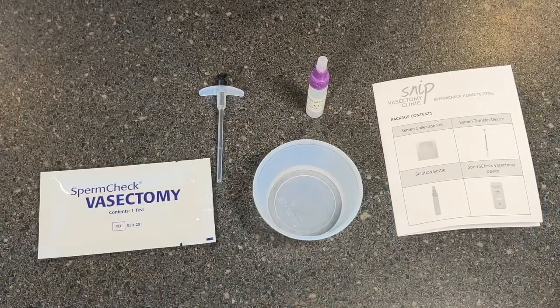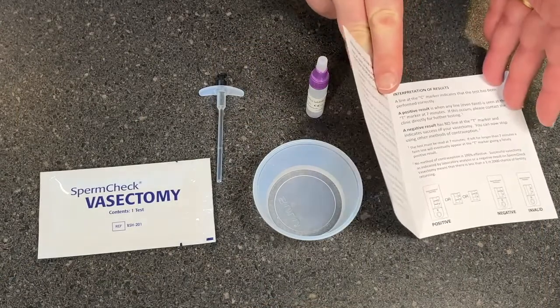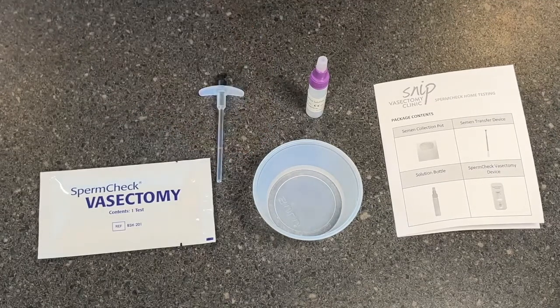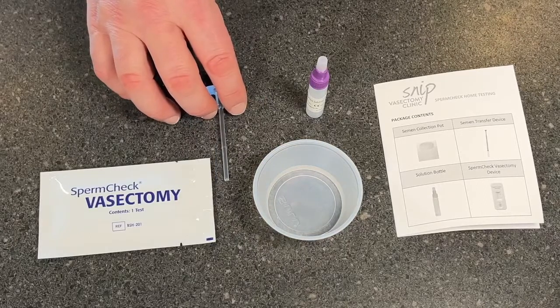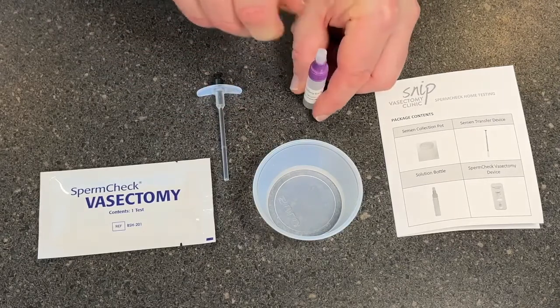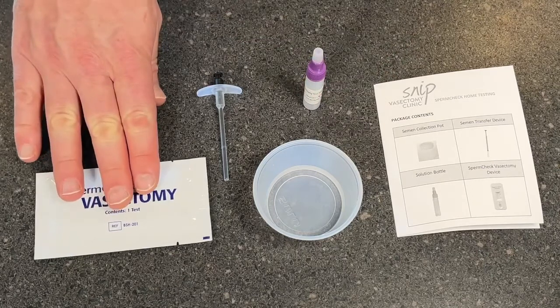I'm just going to show you now how to use the test itself. Inside the SpermCheck Vasectomy kit, you have five things: the instruction leaflet, which opens up to give you all instructions for the process; a little receptacle for holding the semen; a semen transfer device, which you also use as a stirring device; the reagent that you'll mix the semen with; and the SpermCheck Vasectomy test itself inside a packet.